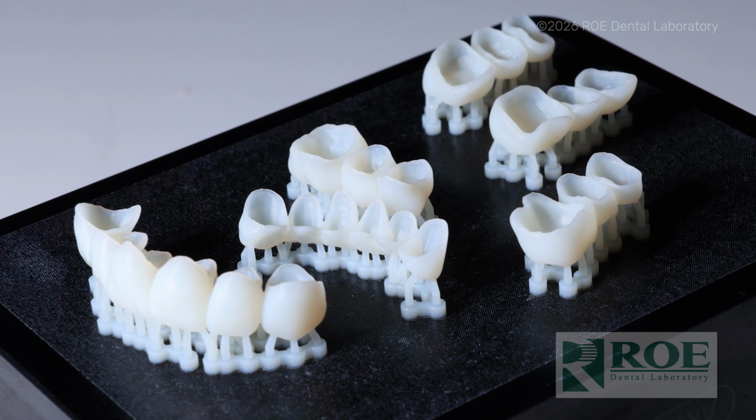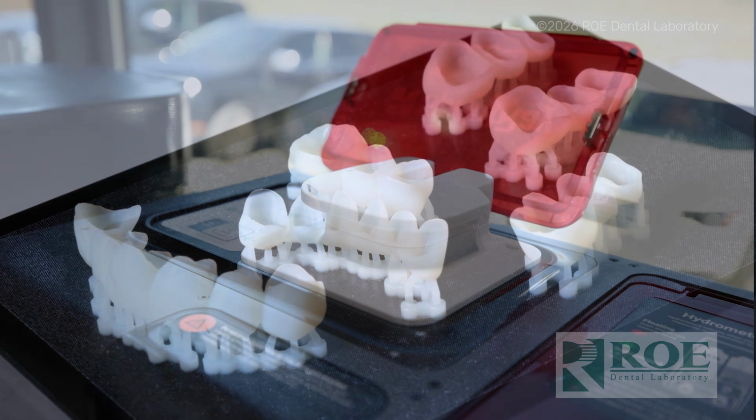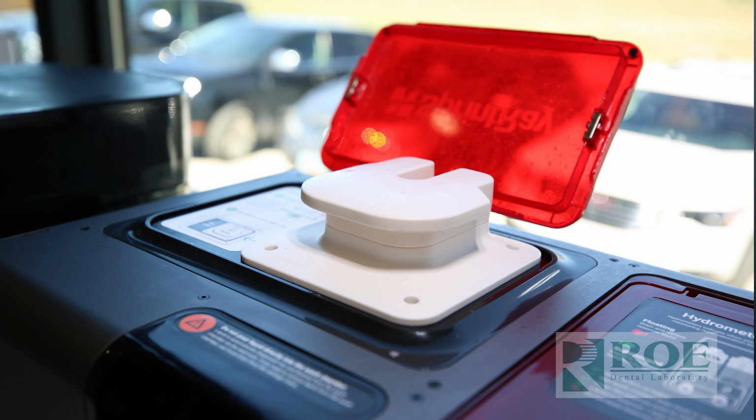The other reason things don't fit is when we get resin on the inside like this, because we'll flip upside down inside of this. We always see photos like, oh, this looks so beautiful. It doesn't look like that when it's coming out of the printer. It's an ooey gooey mess. And so we have to take this and wash them. And washing it with alcohol is the critical component to make sure there's no excess resin, because if there's excess resin, these things will not seat. It defeats the whole purpose.